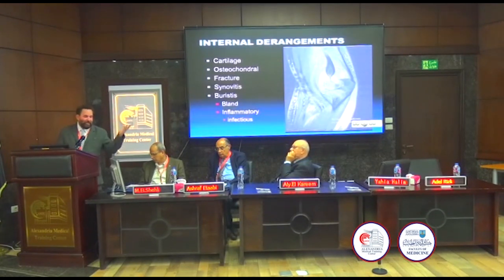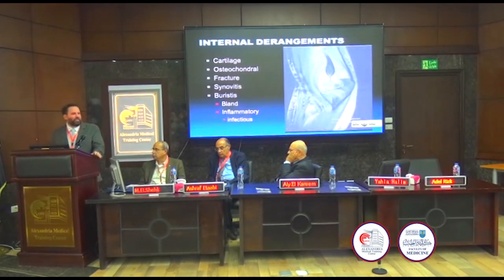So I have to go there and hand edit every single report, not just elbow, every single report says no joint fluid is seen. A small amount of joint fluid is normal. So how much is a small amount?